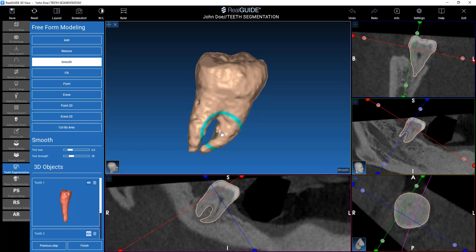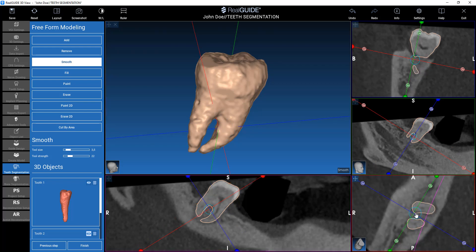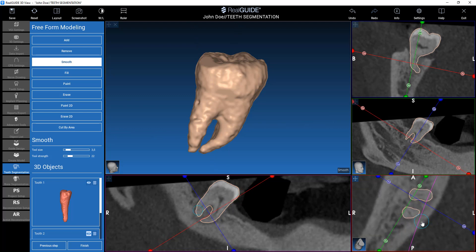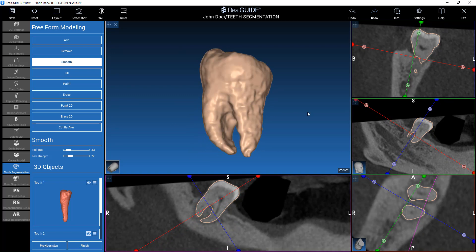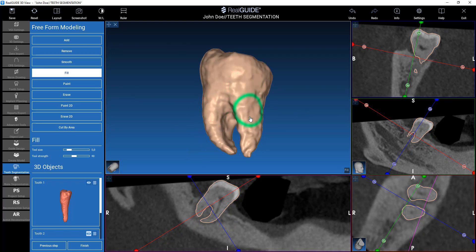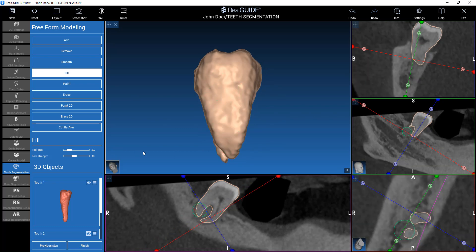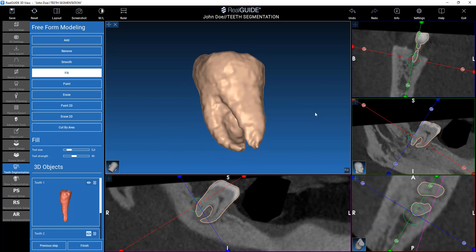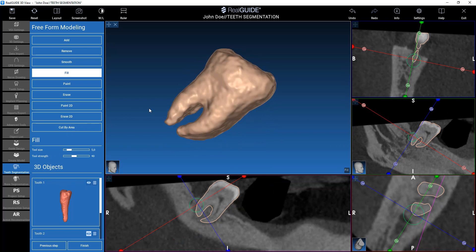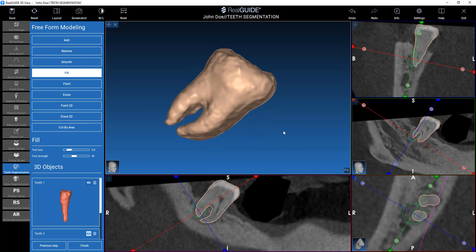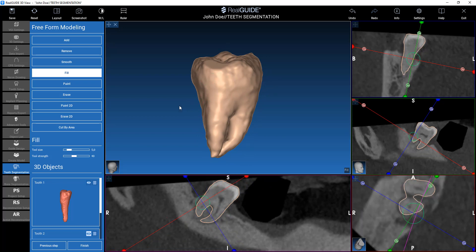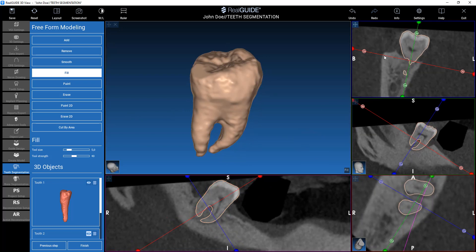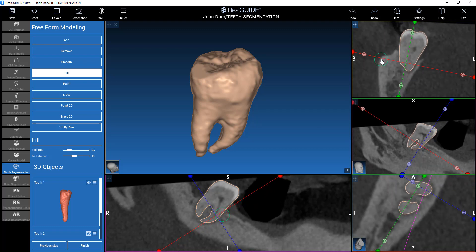For example, I want to smooth a little bit here. You can be very precise by using freeform tools on 2D images. It's better to use fill instead of smooth, because smooth is basically removing parts, and generally for segmentation it's better to have something that fills the gaps rather than removes the peaks of the surface.